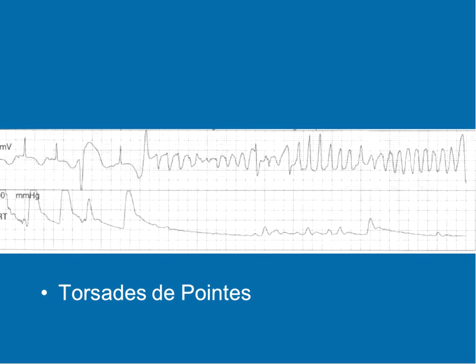And you hurry. This is a polymorphic ventricular tachycardia. It is associated with a prolonged QT interval. Now, I don't remember, I know we didn't spend time measuring QTs when we did cardiac assessment.